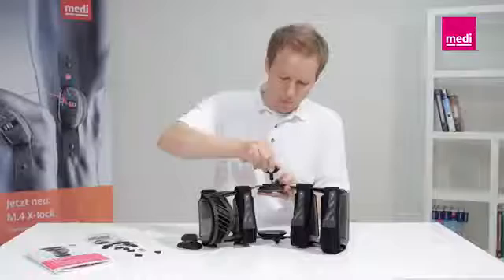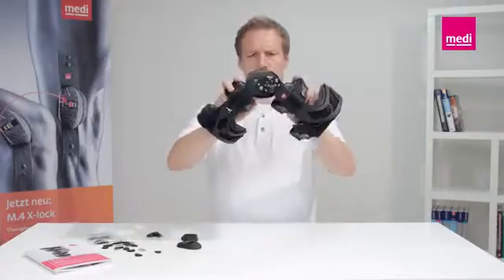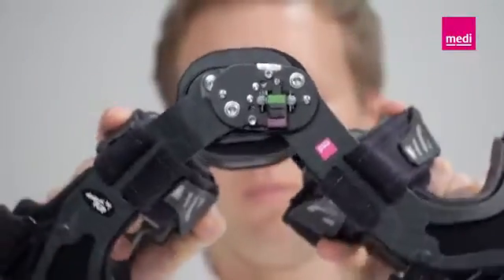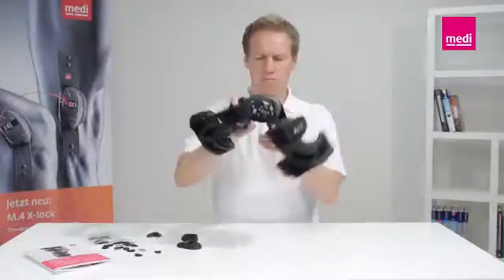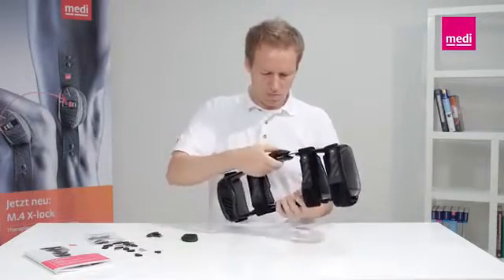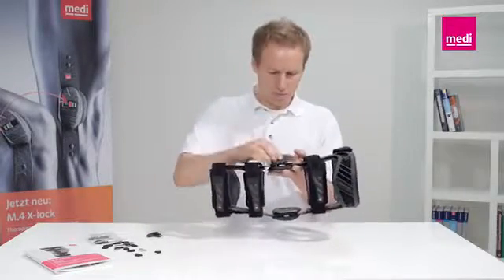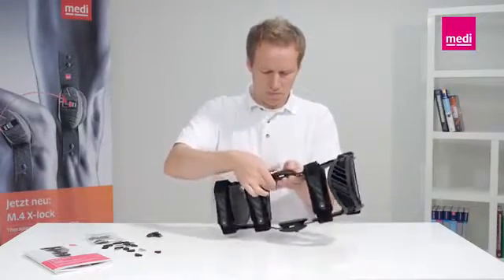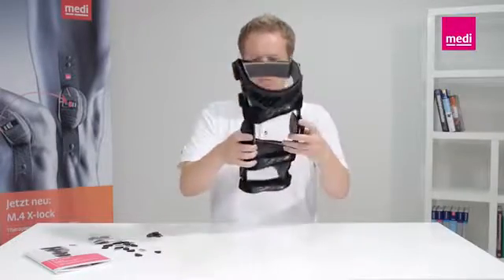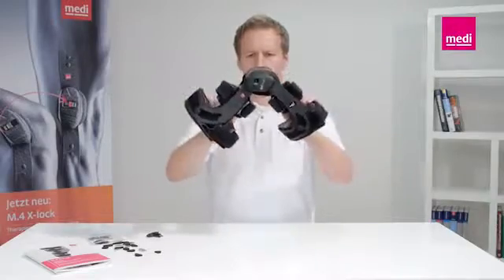Now place the screw in the opening in the thread and screw tight. Now move the orthosis hinges, check the positions of the wedges, and secure the hinge cover. Only the technician treating the patient may change the extension and flexion limits. In order to avoid hyperextension, extension wedges or 0-degree wedges must always be inserted.